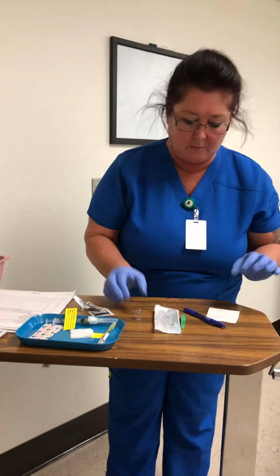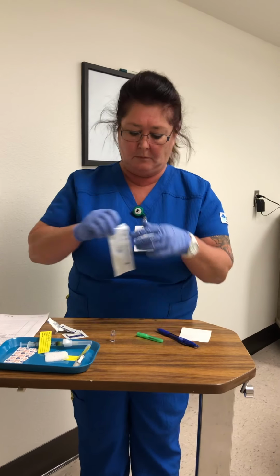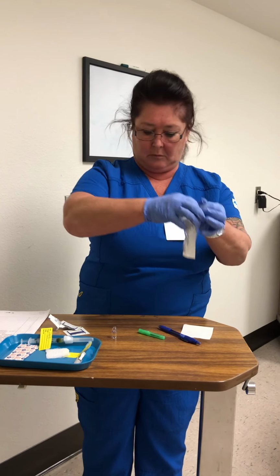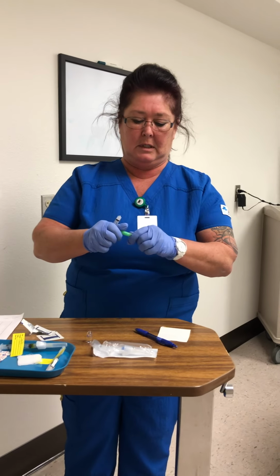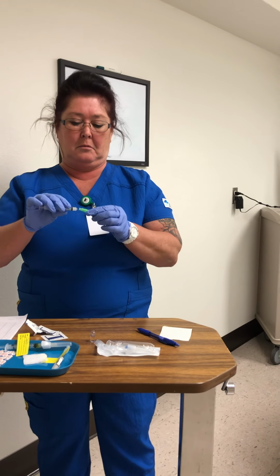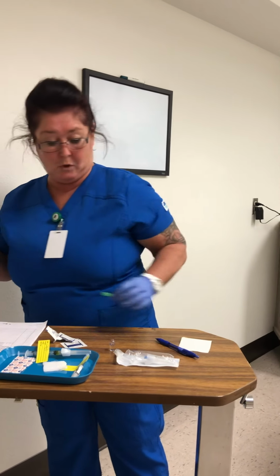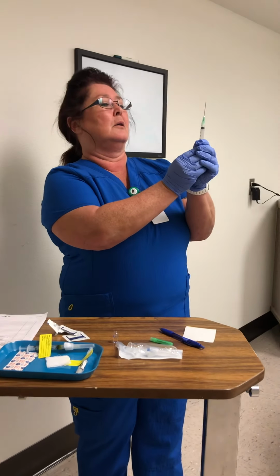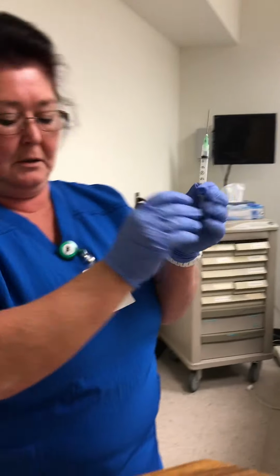Okay. I am going to get my filter needle. And I'm going to attach it here. I am going to draw back 0.5, the 1/2 mil.